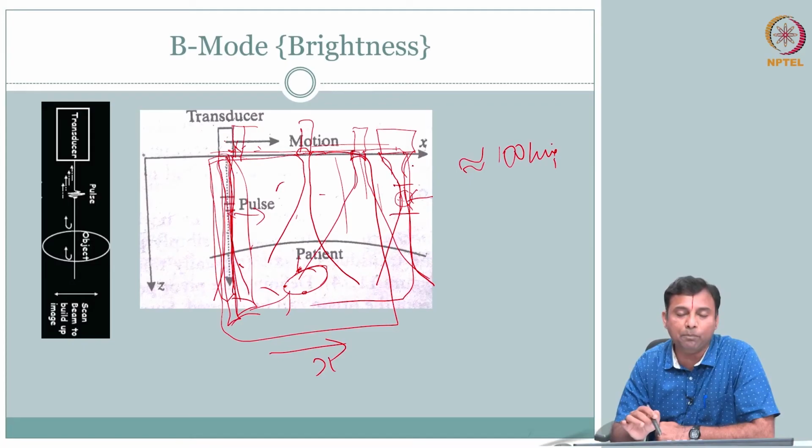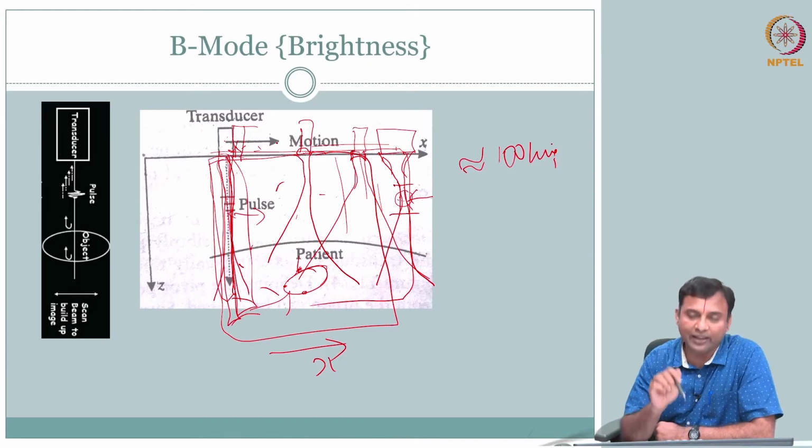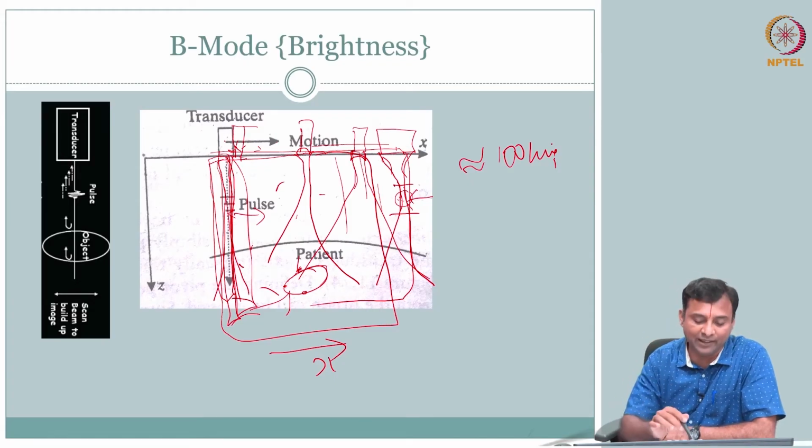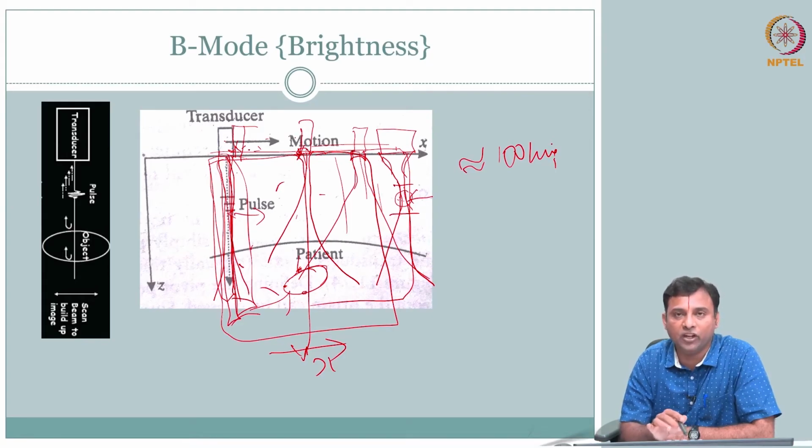One of the other important parameters: of course, that means you have to start your motion, stop your motion, and get the data down to the depth of penetration at that location. I have to go deep and come back. So maybe I halt here, or maybe I move slowly, but the point is there is a time for this motion to take place, start, stop, or go slowly, so that you can receive from the deepest location.